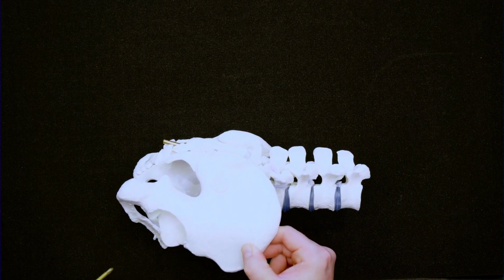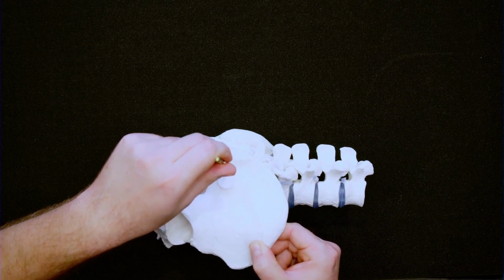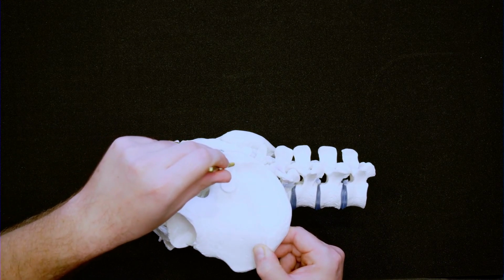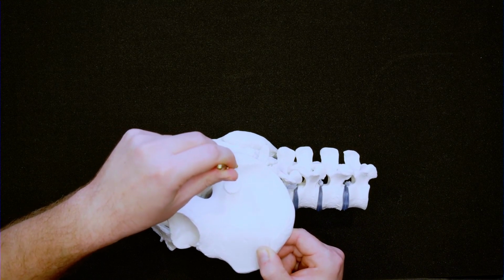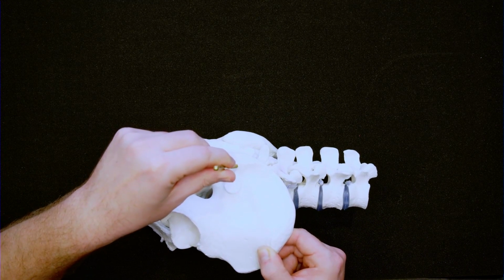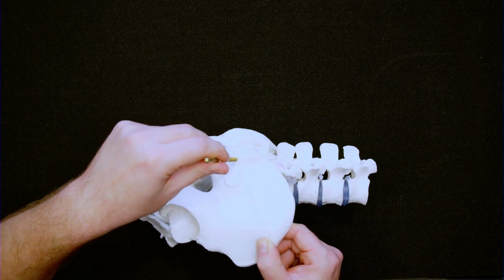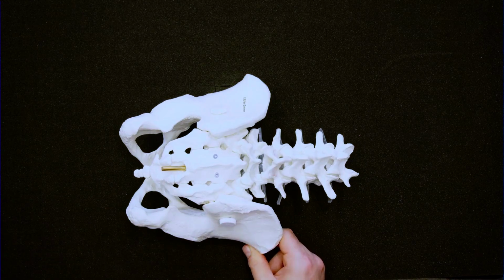However, it's usually not possible to address the SI screw in this position because usually your positioning tools are in the way for your X-ray intraoperatively. If you have radiolucent positioning tools available, it's possible to do it. However, it's easier to go in prone usually for these cases.